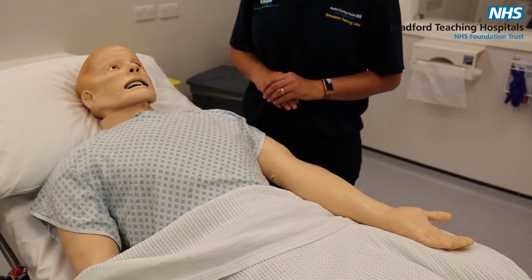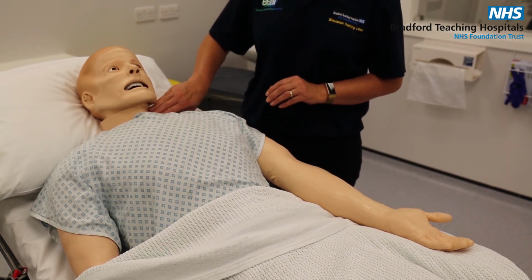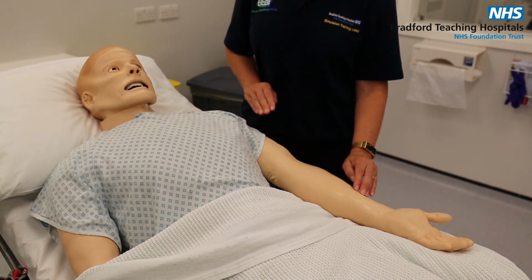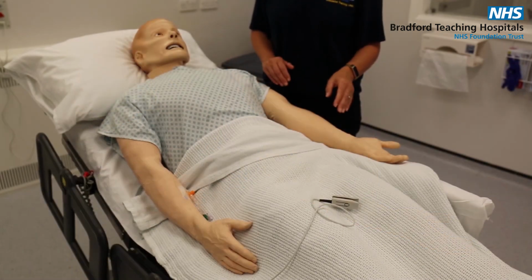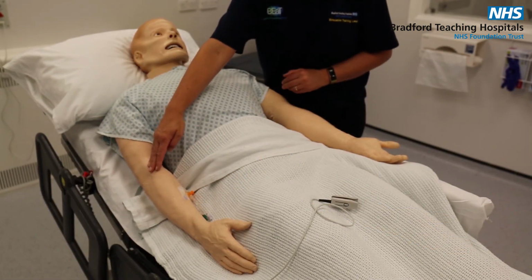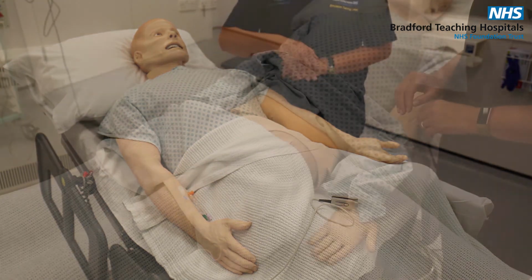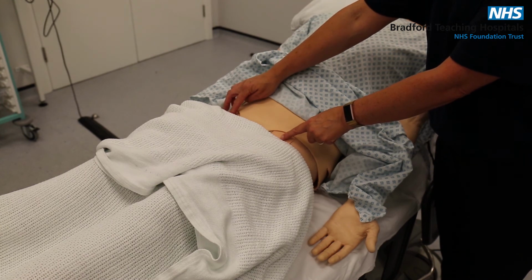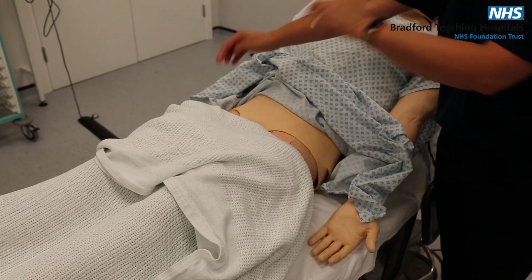So Simman has got pulses. He's got a carotid pulse and he's got a radial pulse, which is slightly higher up the arm than what you would expect. Simman only has a pulse on the left hand side, as this arm is an IV arm. So Simman has bilateral femoral pulses, and these are the easiest pulses to feel on the mannequin.